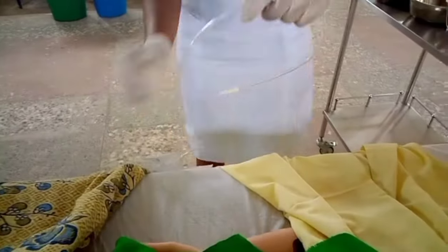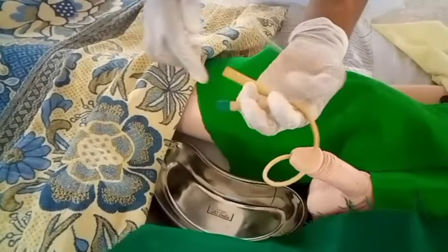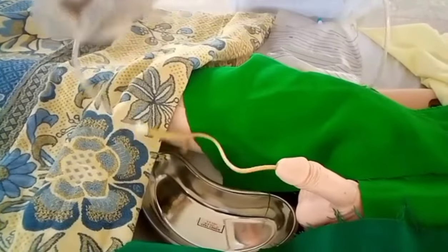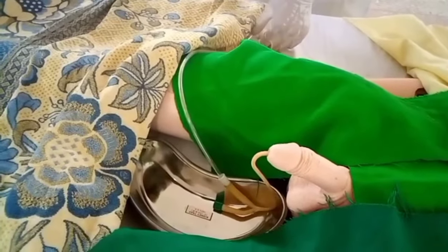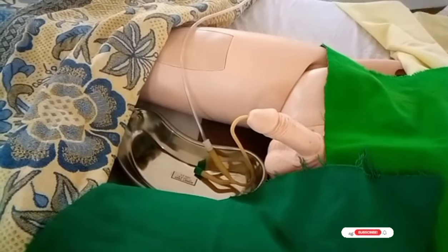After that, take your urine bag, strap it at the bedside, and connect it to the catheter. Note that the port where you injected the sterile water is different from where you connect the urine bag.